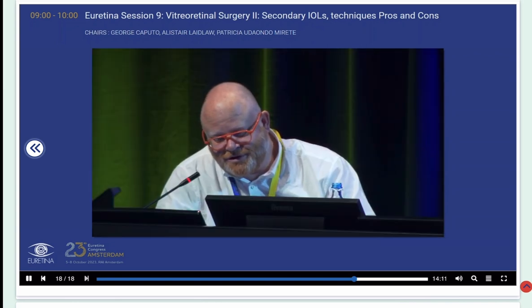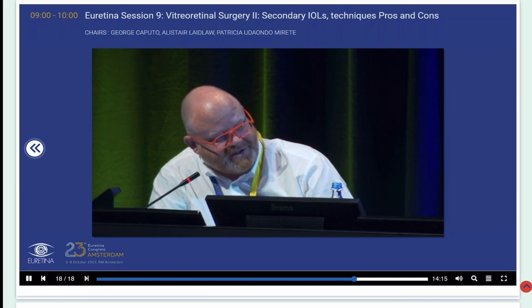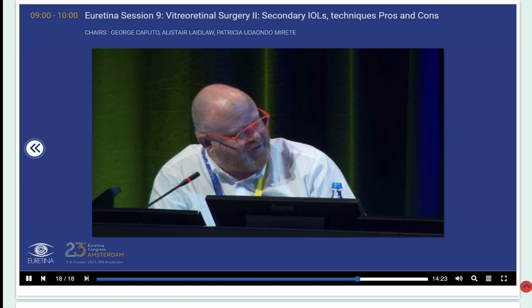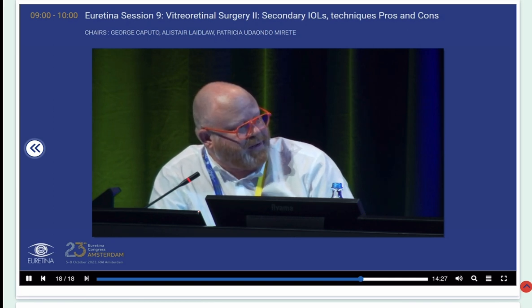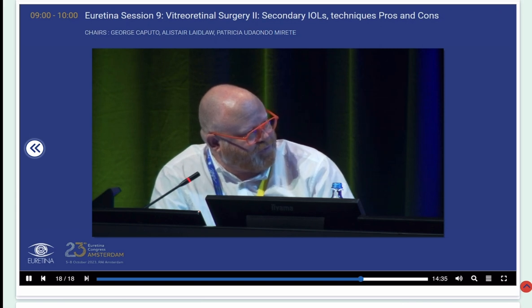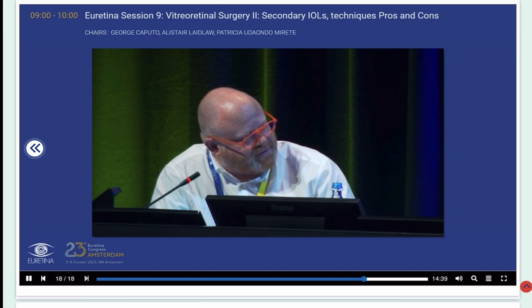I always go for the scleral approaches in the form that I place my incision far back. So I really go for the old school scleral incision. So I open the conjunctiva and do the full 5.5 millimeter scleral incisions. So to be really back from the cornea. I usually do my Artisan lenses with dropped nuclear or dropped IOLs. So I'll do a full vitrectomy and I always place them on the posterior side.